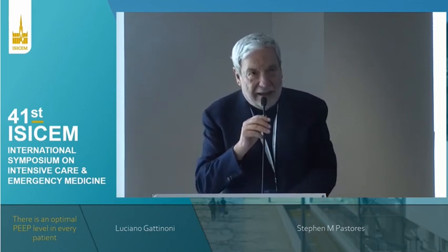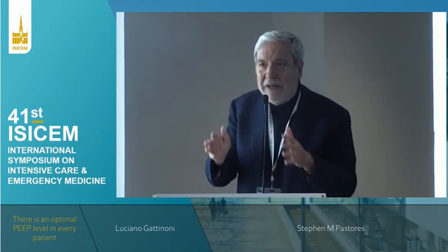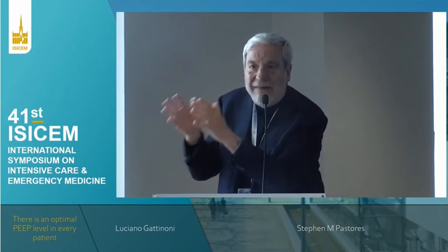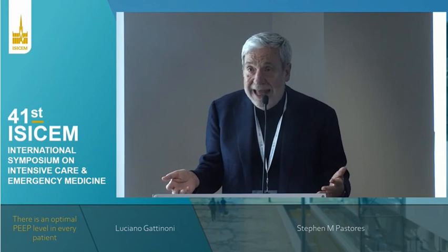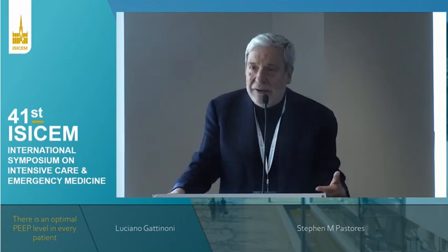So even to start, be careful when you start with a table that gives you 20 of PEEP. Because when you start with this table, to give 20 of PEEP, you fill the patient with water.